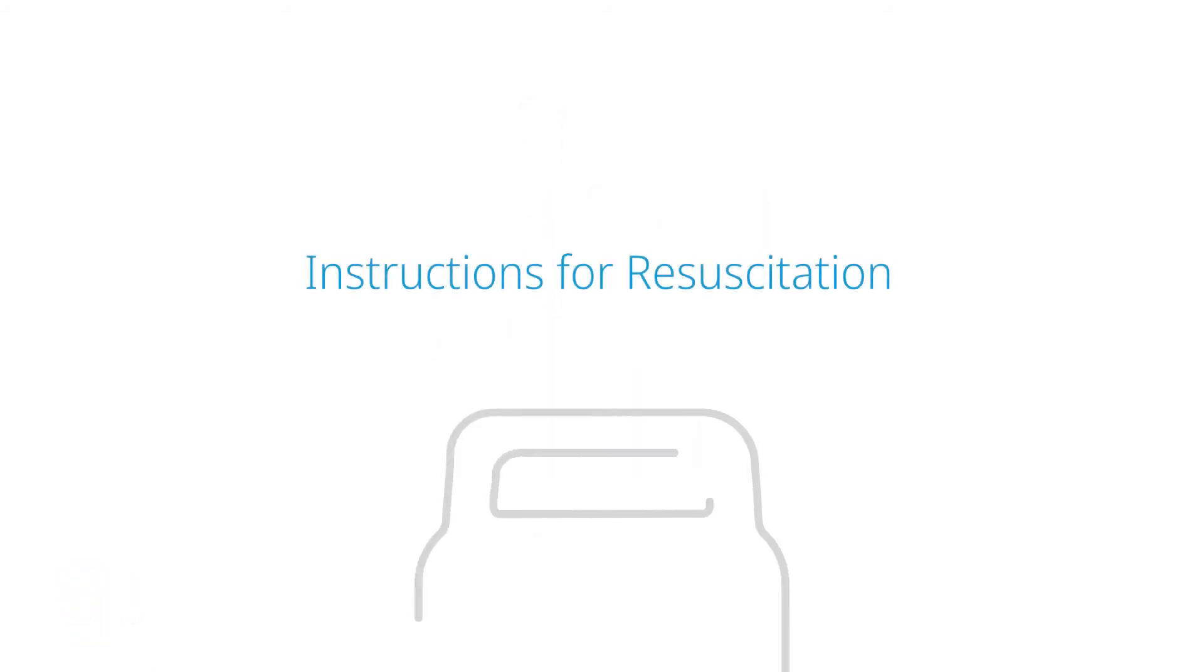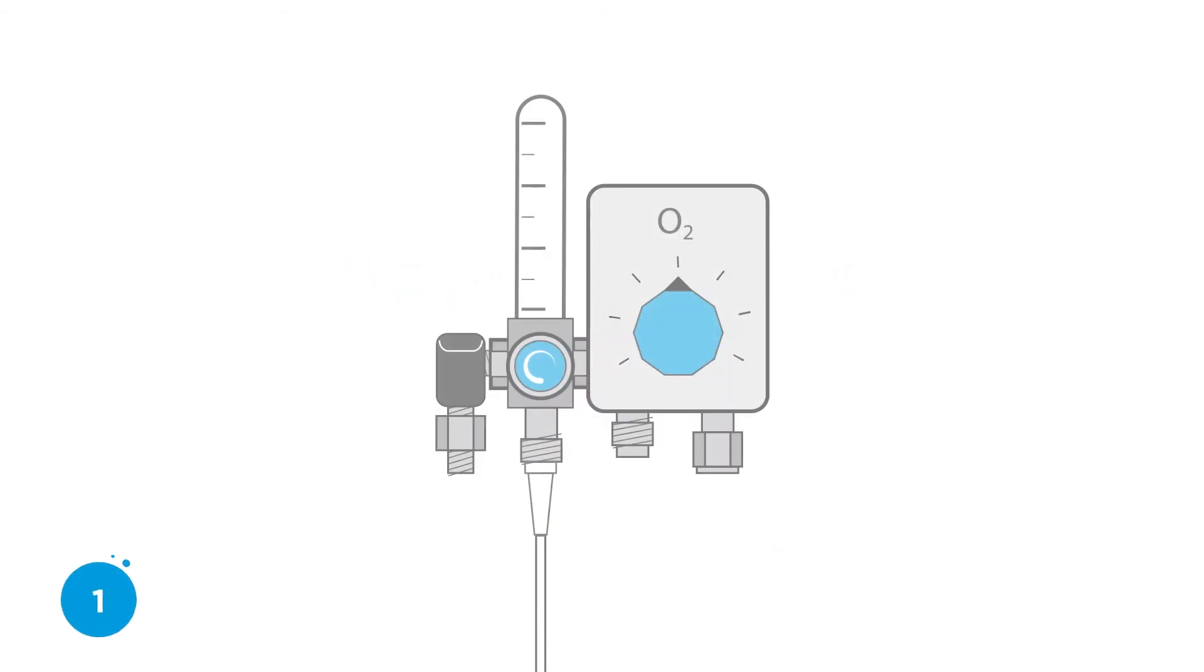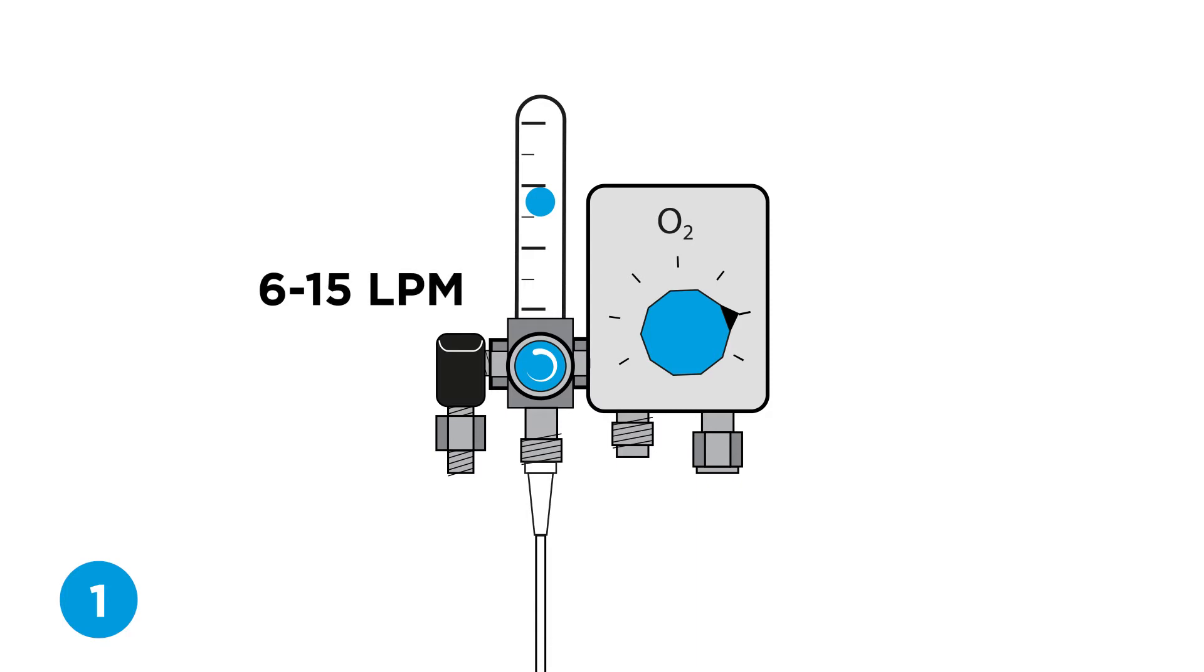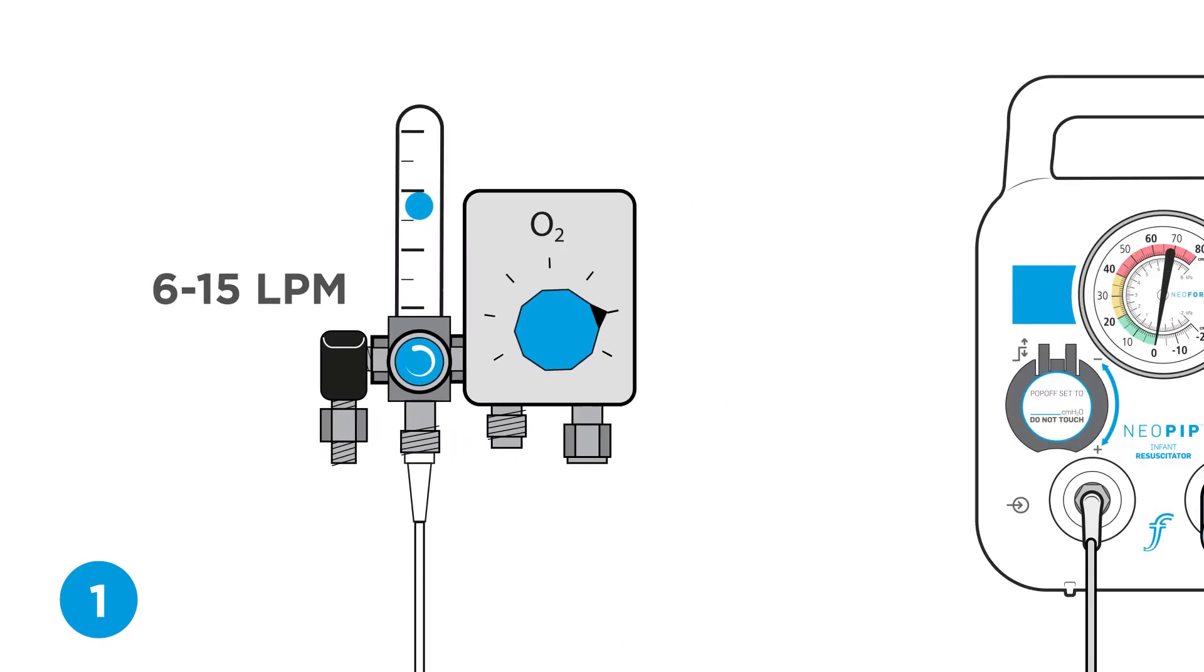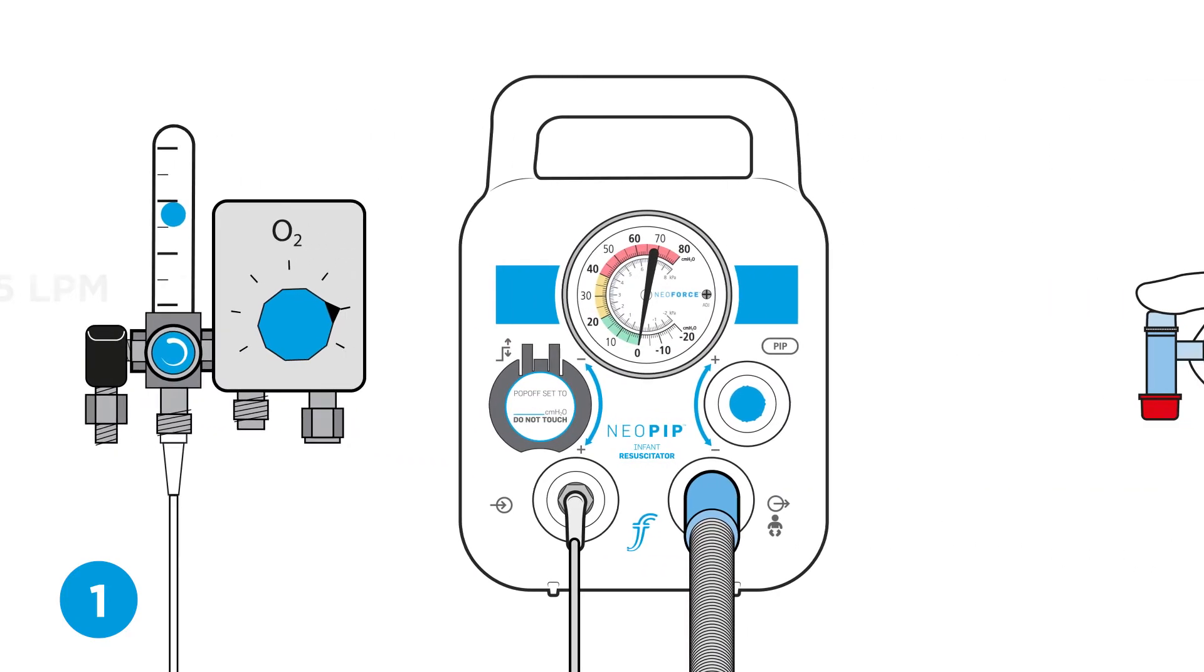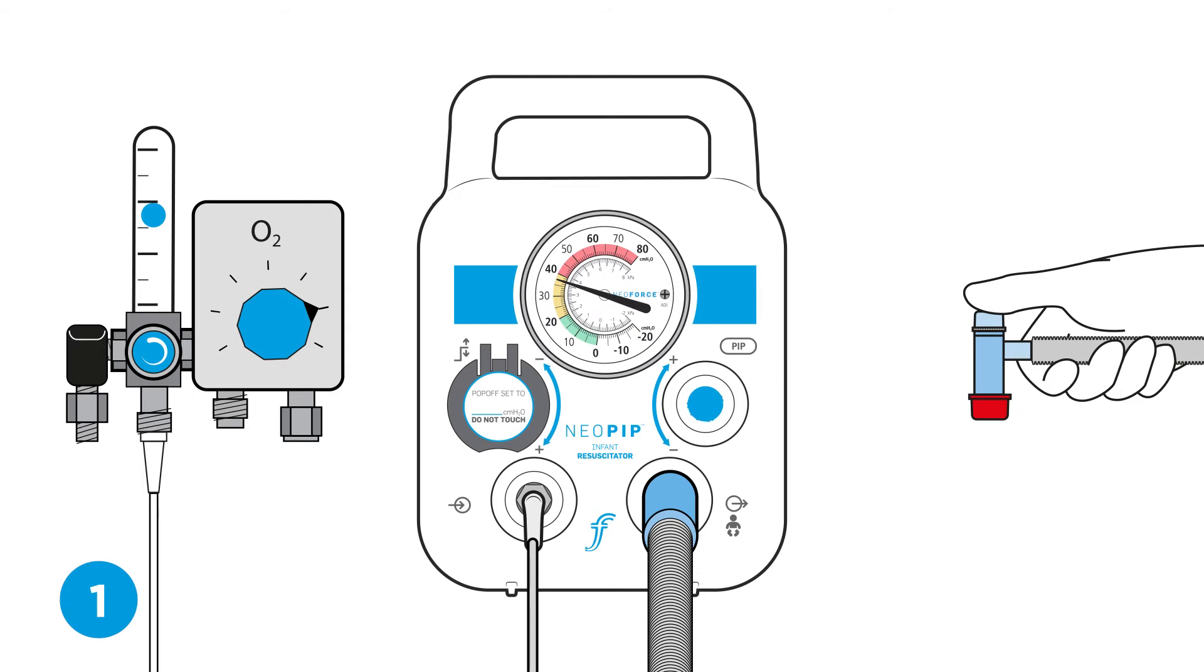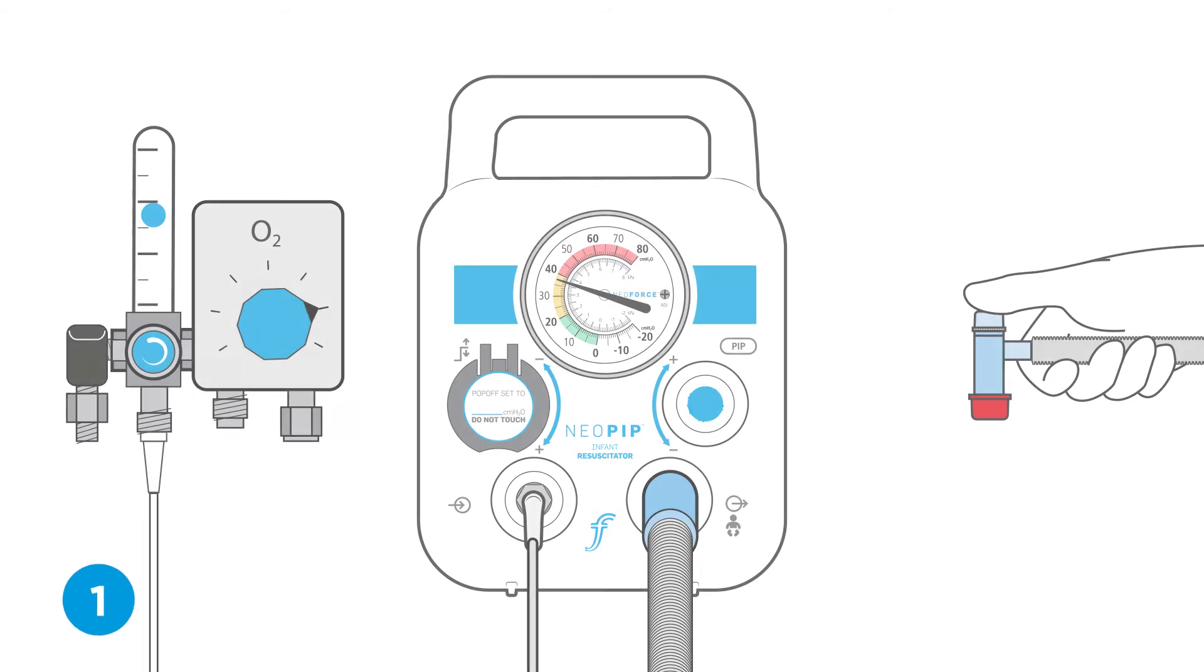Instructions for resuscitation. Step one, set flow rate and check PIP. Turn on the gas supply and set the desired flow rate between 6 to 15 liters per minute. Turn the PIP control in both directions while occluding the PEEP valve. Confirm pressure adjustment on the pressure gauge.